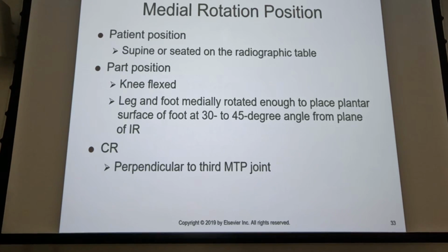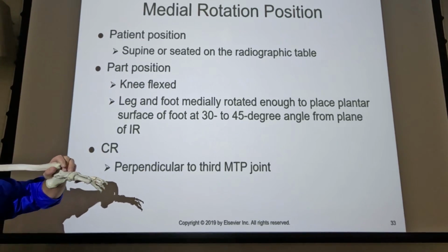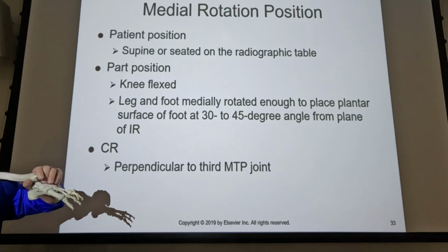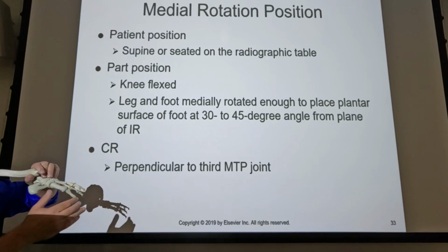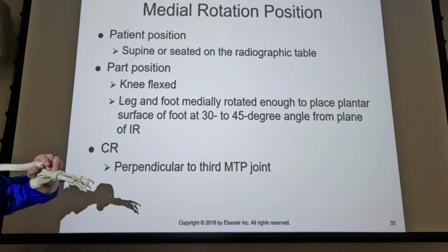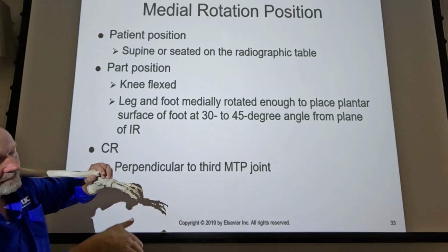All right, so now look at the wedge shape of the foot. All of our obliques for the foot are going to be medial obliques, internal rotation obliques. Now the reason that we use that 15-degree angle, all of his toes are upside down. The reason we use that 15-degree angulation is because the toes are at an angle, right?